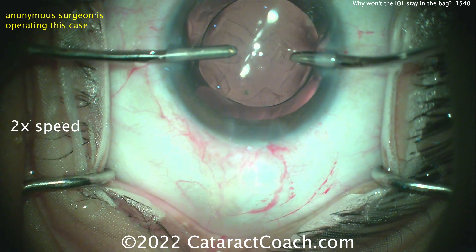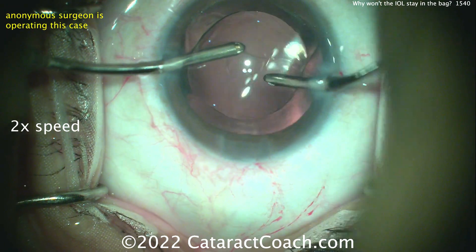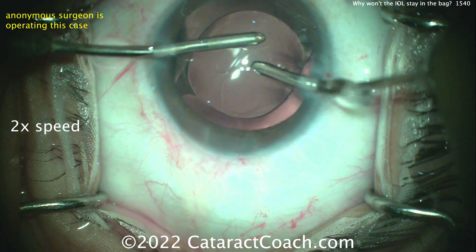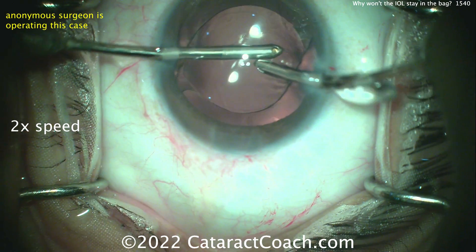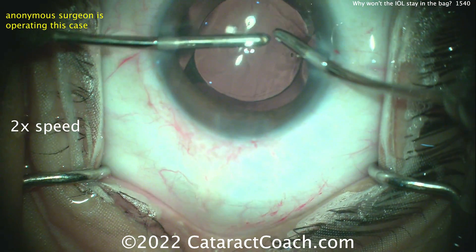Now bimanual irrigation-aspiration to remove the viscoelastic. What's our rhexis size? Looks pretty reasonable — there's a reasonable overlap of the optic by the capsular rhexis, so I don't think that's too much of an issue.